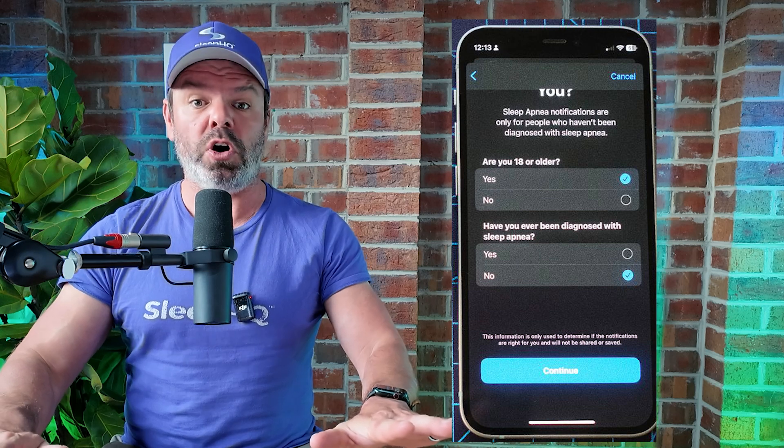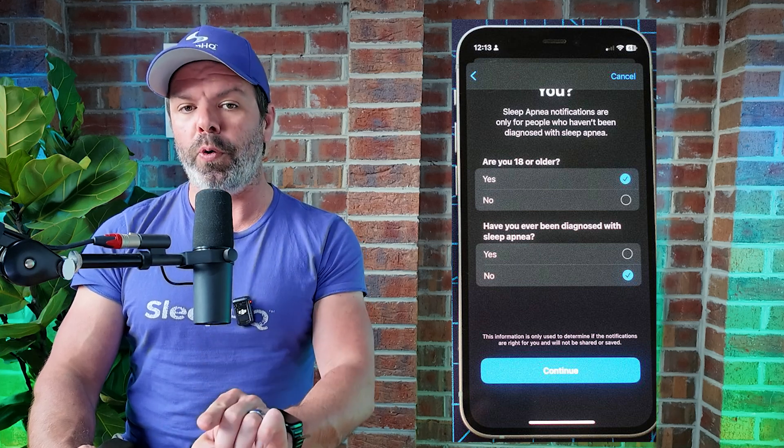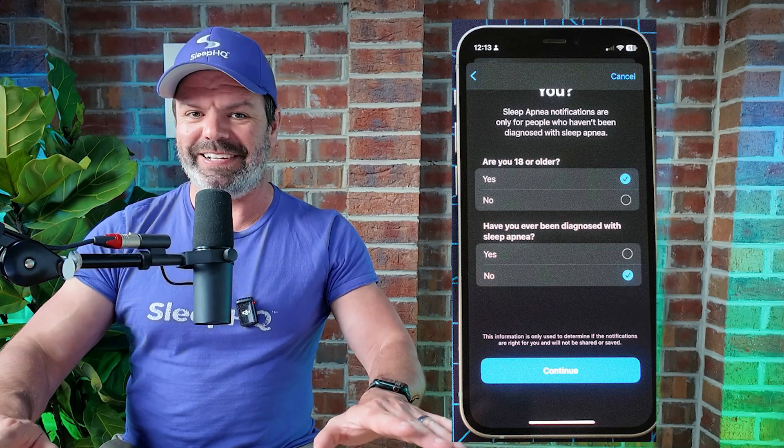The first question: are you 18 or older? Make sure you select Yes if you want access to this feature — if you select No, the feature is gone. The next question: have you ever been diagnosed with sleep apnea? Make sure you select No, even if you've been diagnosed, because if you select Yes the feature is gone. This feature will be really important for people diagnosed with sleep apnea who are using CPAP machines, because CPAP machine reporting isn't very accurate. If the watch shows elevated respiratory disturbances while you're using your CPAP, it tells you your CPAP machine perhaps isn't doing a great job and you may need to adjust your settings.